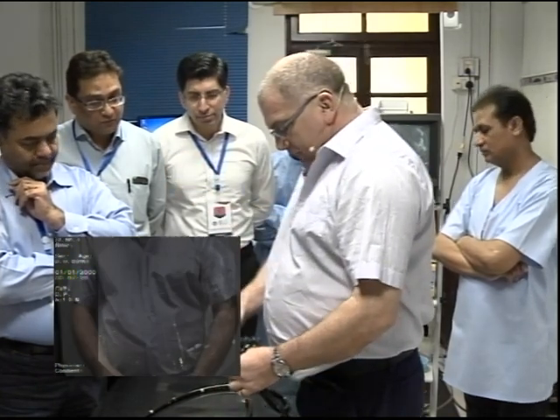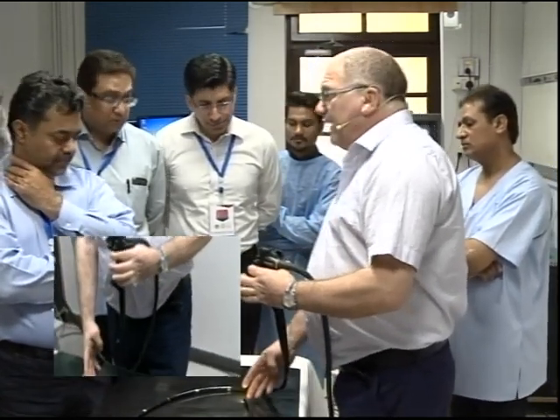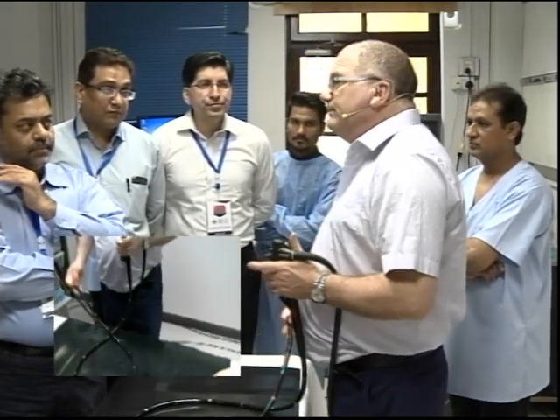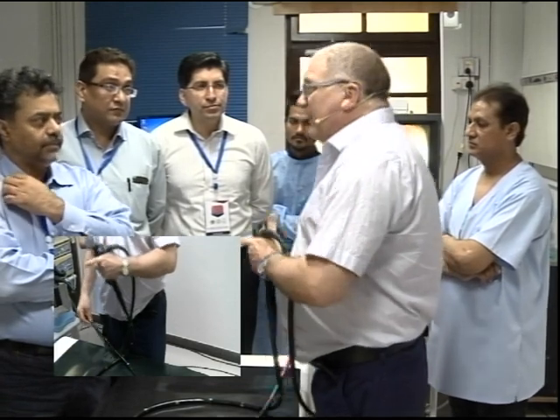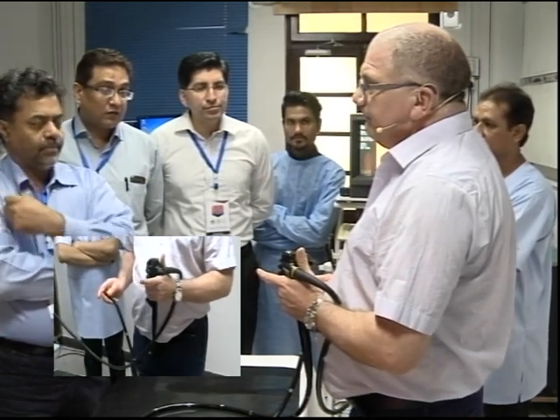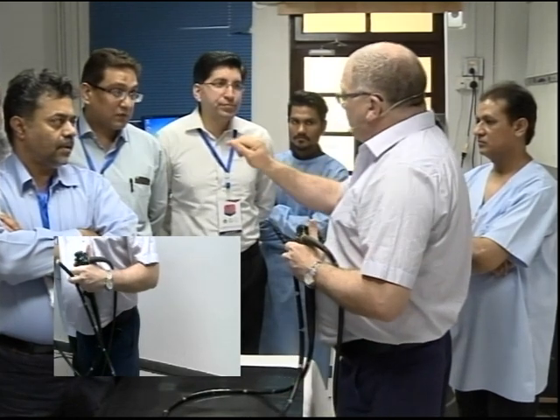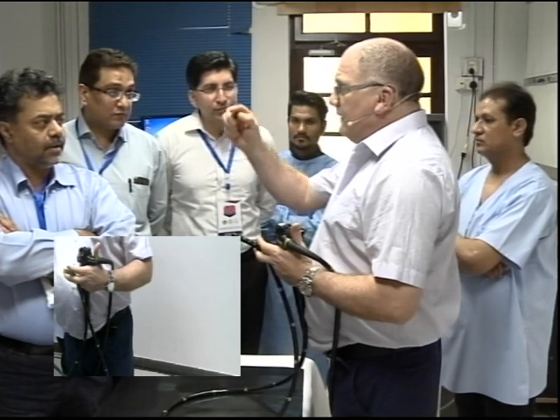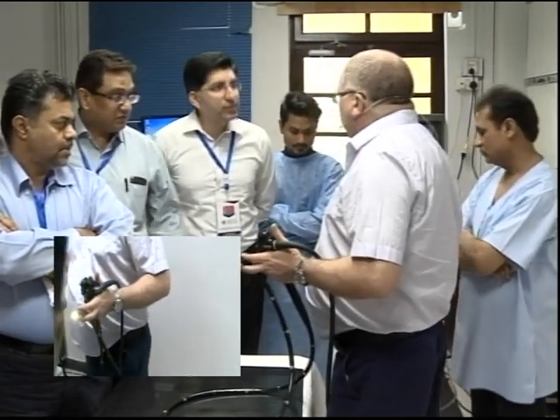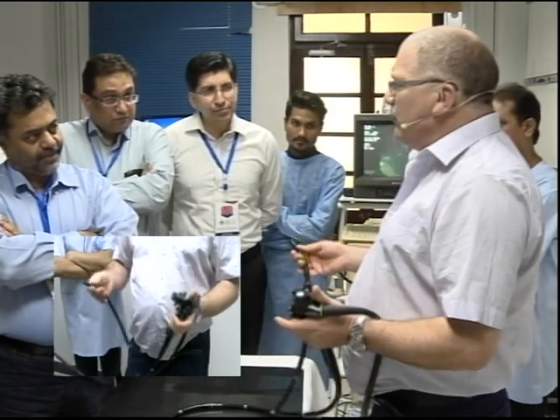What's the most important part is these bungs. Can you see now we've got water? So as soon as we actually touch this, that's just air. But as soon as we press it, we can get water. See it? Why? That's its purpose. That's the purpose of the water. But why does the water come out? Right, so you've covered the air. You press it in, the hole is moved across, the rubber seals the gap, the air then goes into the water. The water then is propelled back up, so it diverts the air into the bottle. Okay? So why do you think I'm getting you to understand that?